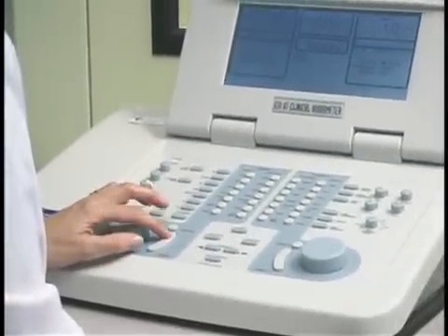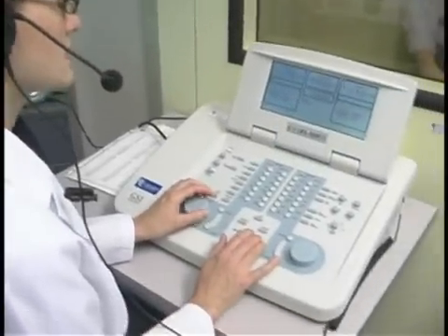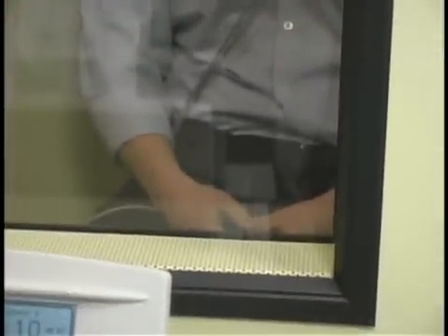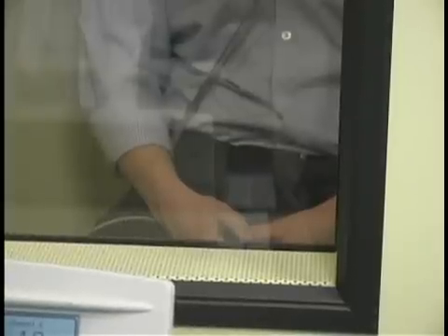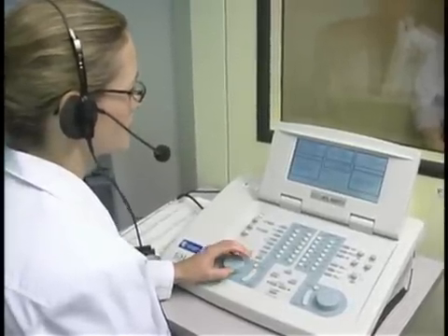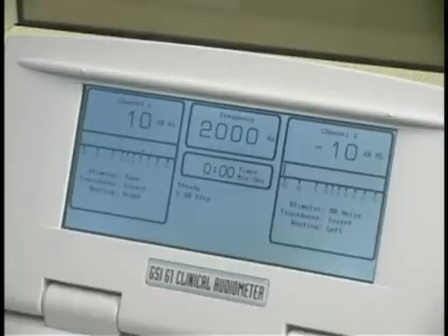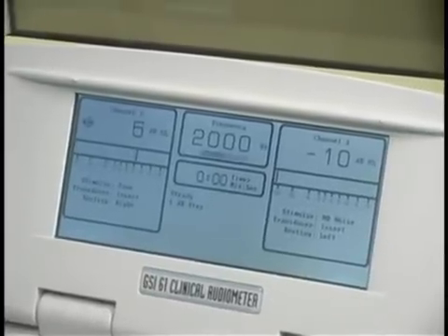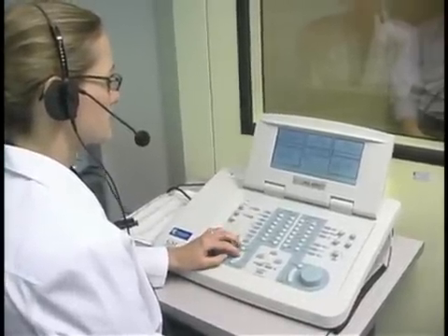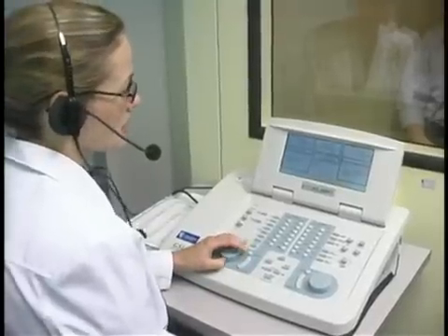The first frequency we've evaluated is one thousand hertz, which is kind of in the middle of what we refer to as the speech frequencies. Next we'll go up to two thousand, and again I'll start at a level where I know he can hear, then drop down in steps of ten decibels each time he responds. You try to change the delay between presentations of the tones so they don't get locked into a pattern or rhythm. We do this for frequencies from 250 hertz up to eight thousand.